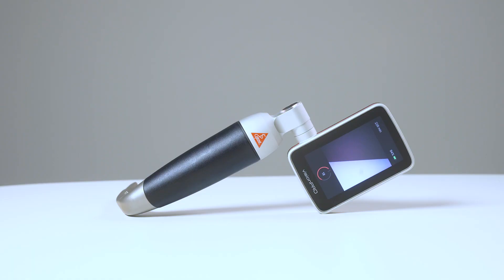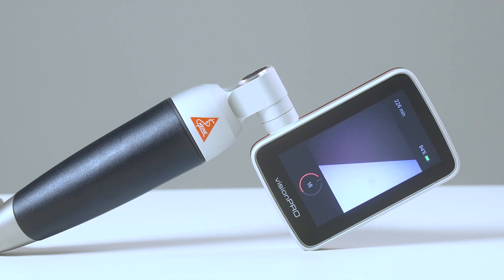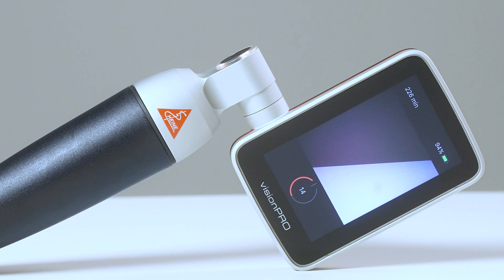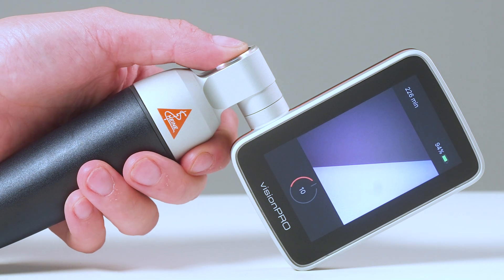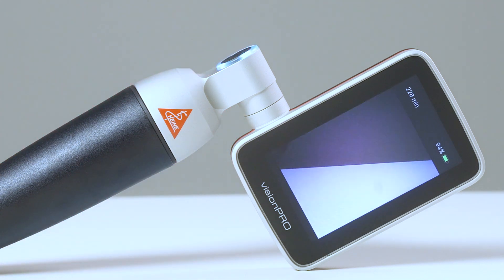The Heine Vision Pro comes with an auto-off feature. The device switches off automatically after 15 minutes without activity, indicated in the bottom bar with a 30-second countdown. In case you want to interrupt the automatic switch-off process, press the on-off button briefly and the 15-minute countdown starts again.